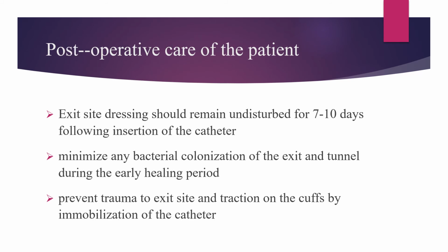The post-operative care of the patient includes, but is not limited to, the following: the exit site dressing should remain undisturbed for around 10 days after the insertion to minimize any bacterial colonization of the exit and tunnel during the early healing period.